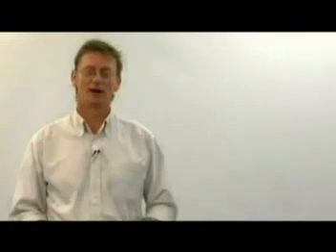I'm now going to illustrate this with a rather crude, but I've found effective, way of demonstrating how simple the outflow tracts and ductal and aortic arches are.